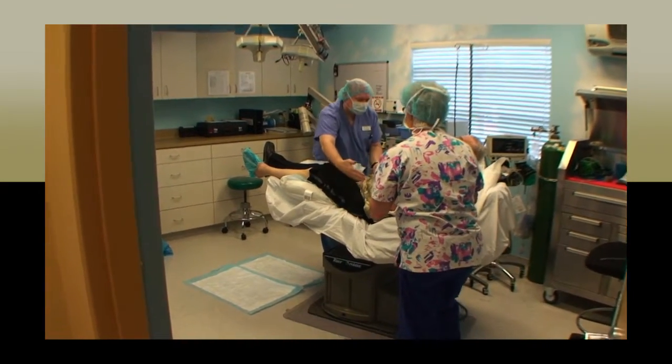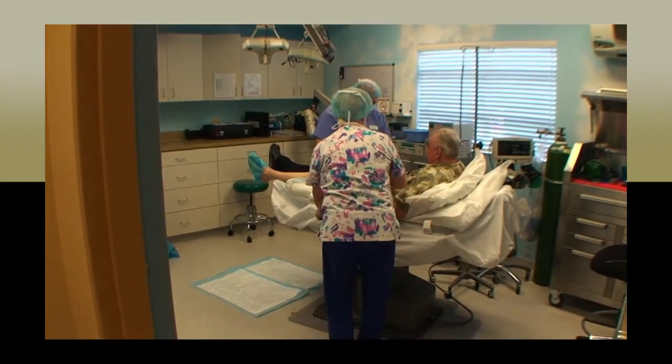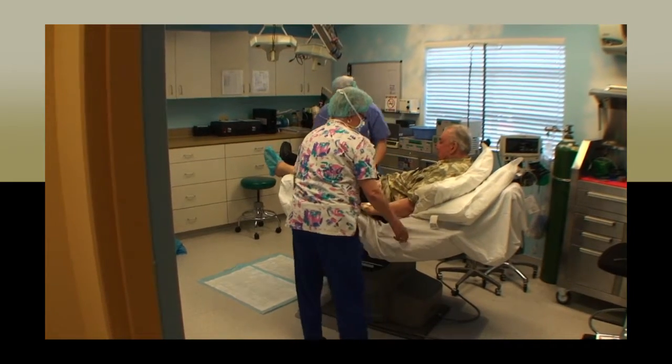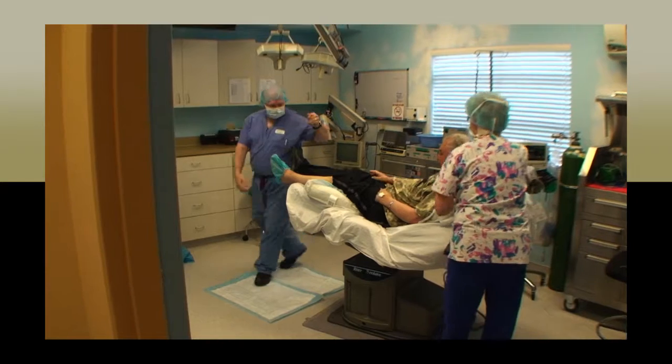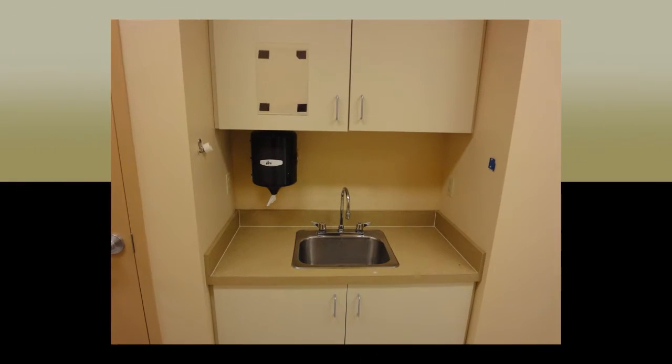At any time the patient moves during the procedure, reassessment should be done. When all the materials and instruments necessary for the case are on the sterile field from the circulator, you will exit the OR to the scrub sink to prepare yourself to be gowned and gloved for the procedure. To perform a surgical scrub, you must remember that the idea is to sterilize your hands as well as possible before placing a sterile gown and gloves on.